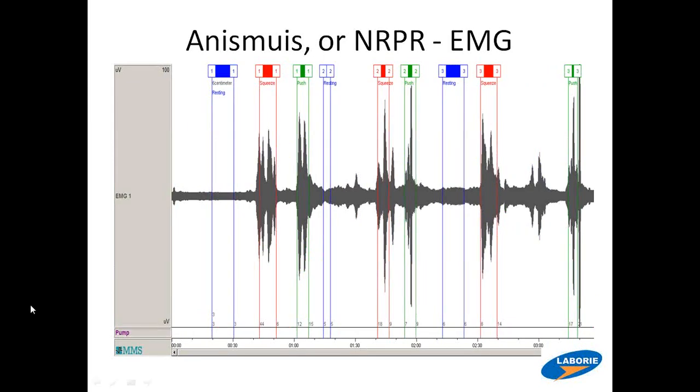Well, he had what we call a paradoxical pattern. It's not what you'd expect. So the normal pattern is rest 4, squeeze over 15, push about the rest. And every single time, and I did 3 times with him, had him push, and he had these little twitches there, but it was definitely he could not relax that muscle.